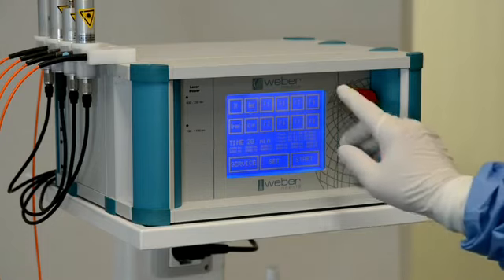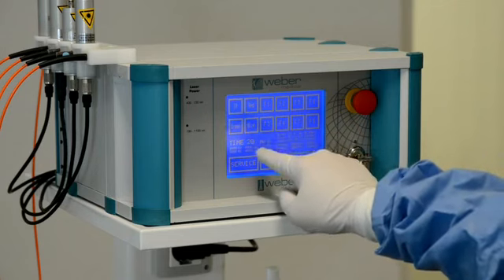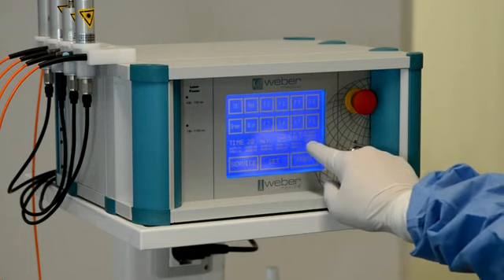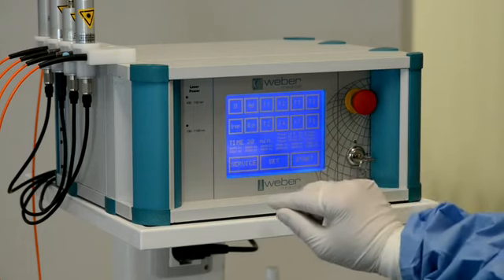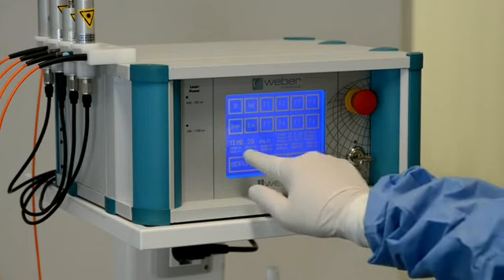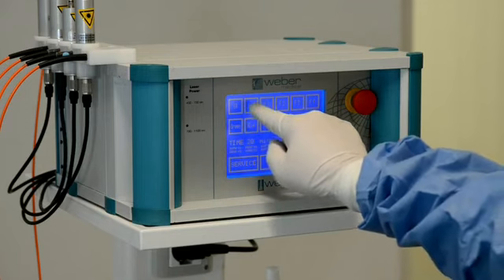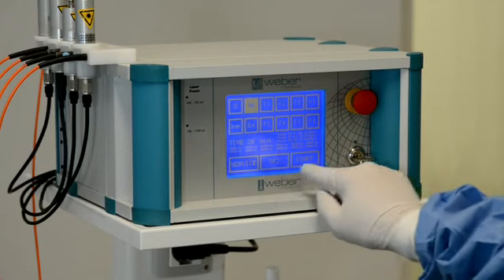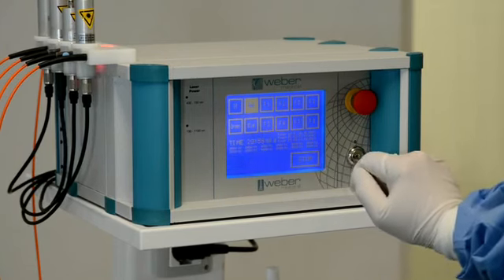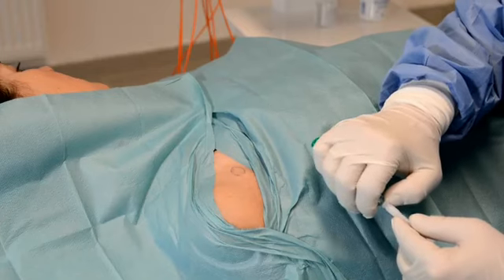For the therapy of the patient we normally use red and infrared laser, and mostly, especially if it's a chronic case, we start with the red laser first for about 15 minutes, and later we treat 15 minutes with the infrared laser. In case of inflammation and redness, or maybe if the area is hot and inflamed, we prefer to give only blue laser because of its anti-inflammatory effects. So I have already switched the red laser on, and we can see it working later.